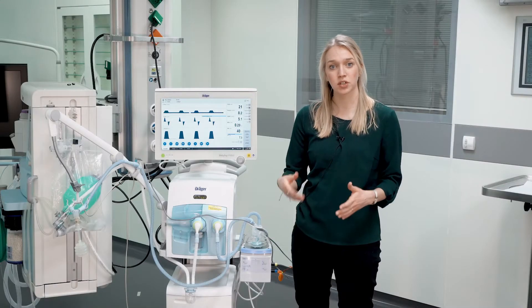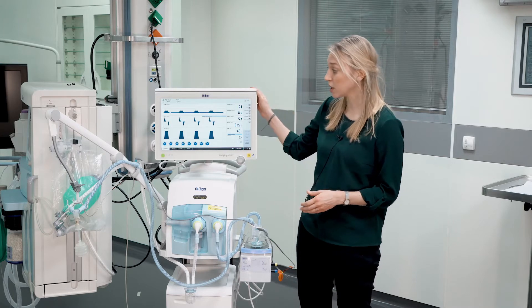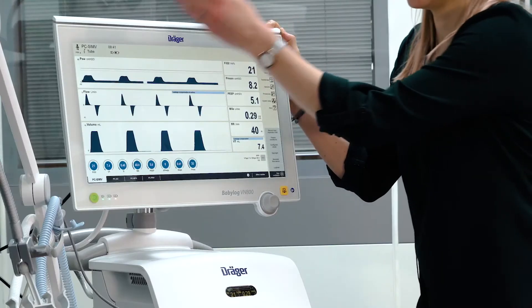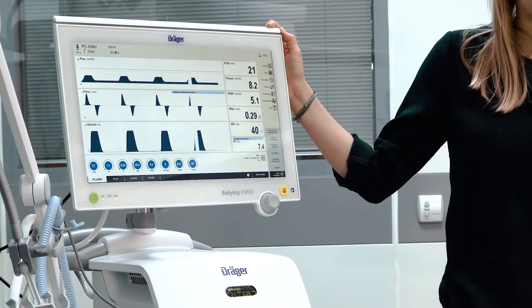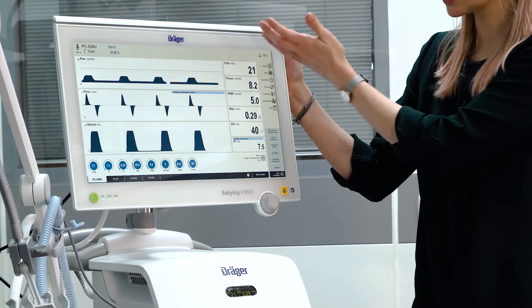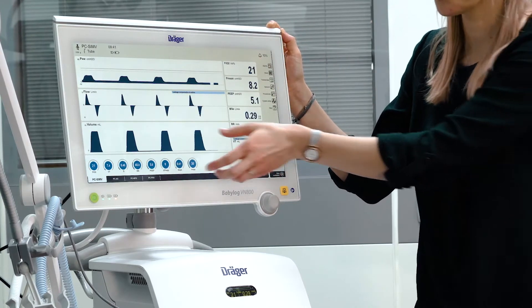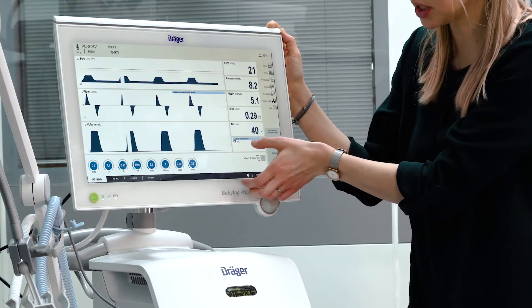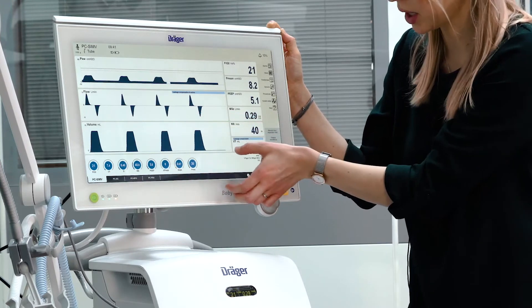We will now demonstrate how to adjust ventilation settings during operation. The screen is structured as follows: In the header bar, you can find your selected patient category and the ventilation mode. In the middle, you can find the waveforms and the respective measurements. You can adjust the settings of your ventilation modes in the lower part here.